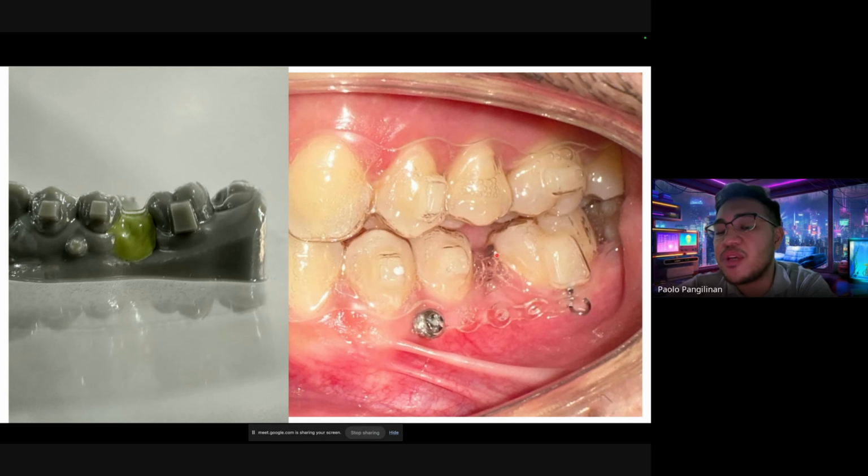My aligners are basically responsible in preventing these molars from mesially tipping, so that I will have room on this molar. So you can see here, I will have room to erupt or to upright this third molar here, and therefore replacing the whole thing. So this is something that we use to make the predictability much better. Now, of course, you know for a fact that uprighting your molars with clear aligners alone is not going to be so predictable. So to increase the predictability, we might have to use auxiliaries, something like this.